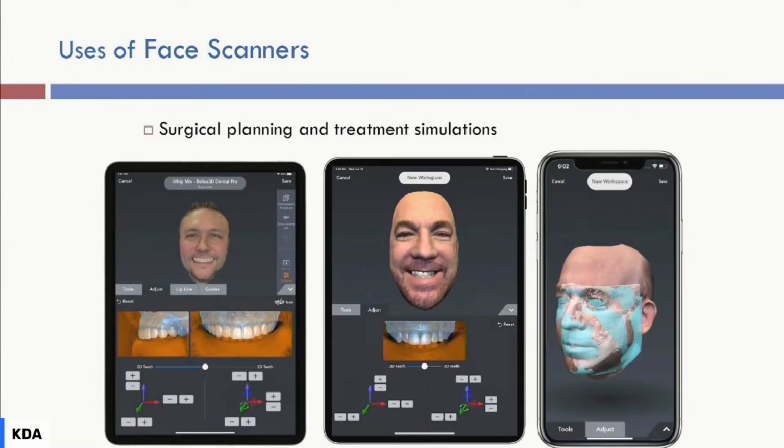And in the field of surgery now, we see that there are a few applications, actually several applications, coming up in recent years, focusing on digital smile design and incorporating facial scans from the outside in order to come up with the right dental rehabilitation. So in this case, it is a mobile application. You take a facial scan of the patient.